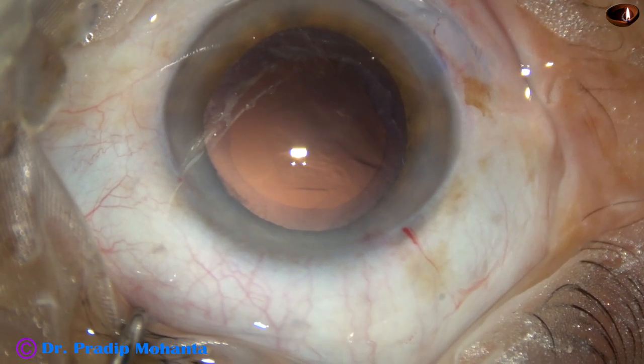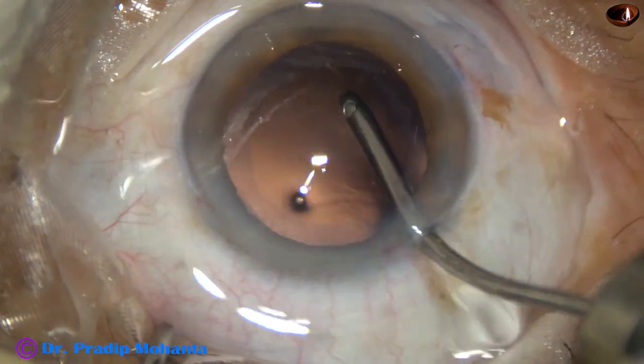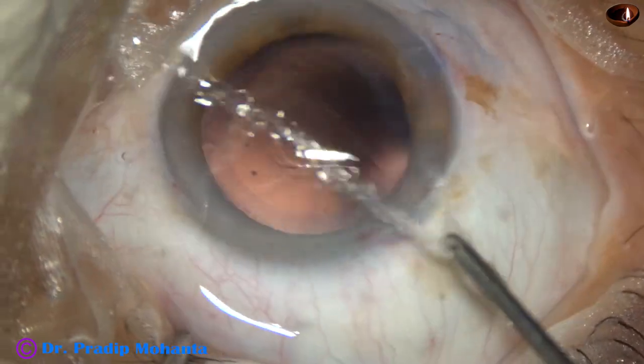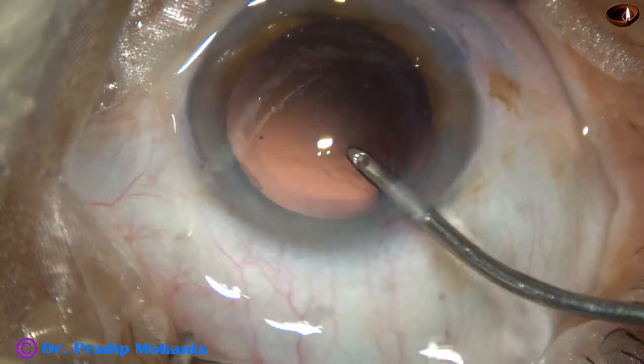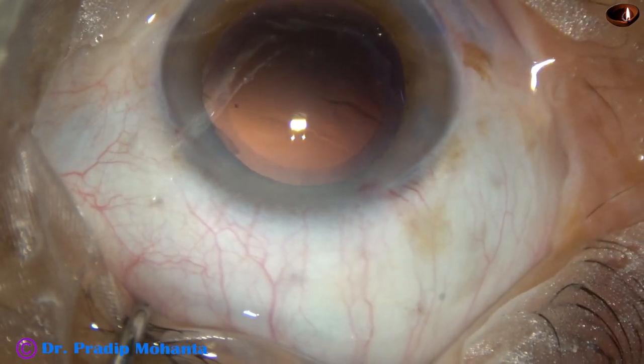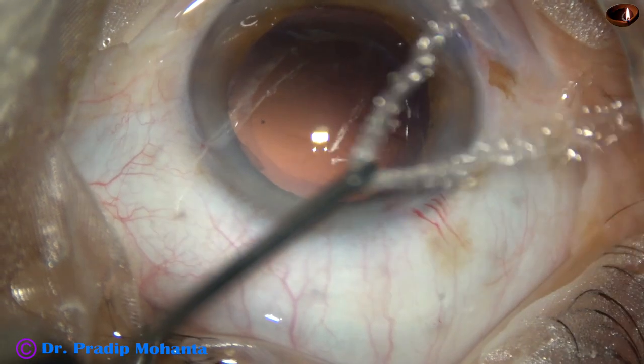Intraocular lens is to be implanted. This is irrigation only — just by irrigation we can do polishing of the posterior capsule. This is called hydro-polish.